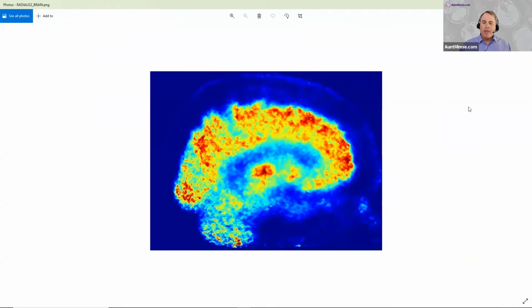Great. So this is our pilot brain image taken while lying between the two sensors. And we're really pleased with what we're seeing initially. We're going to continue to do additional software improvements to be able to do some more tomography work for this type of imaging. We're also going to be looking at integrating more of the positioning. But what we're getting from the range of sensitivity from these sensors has been really flexible in terms of the applications that we can look at.